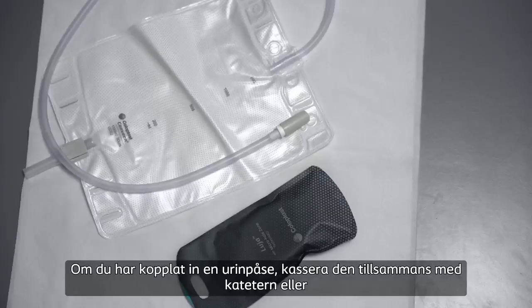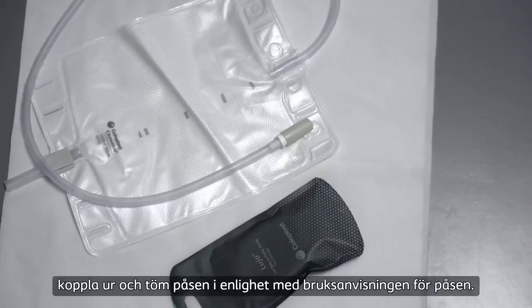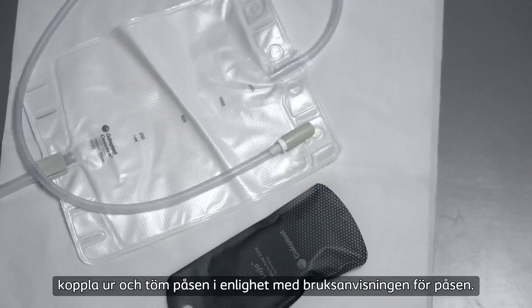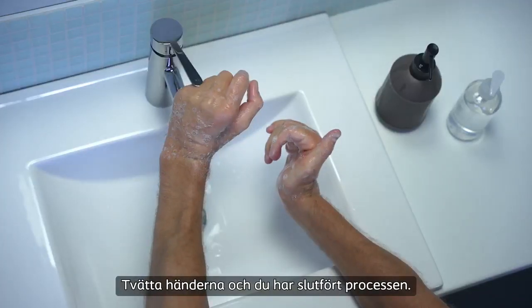If you have connected a urine bag, discard it together with the catheter, or disconnect and empty the bag in accordance with the user instructions for the bag. Wash your hands and you've completed the process.